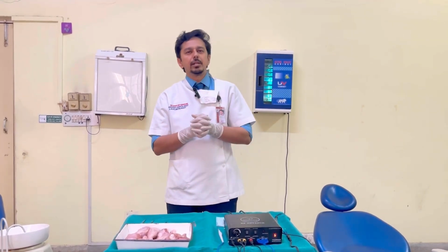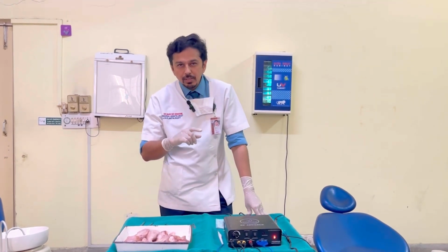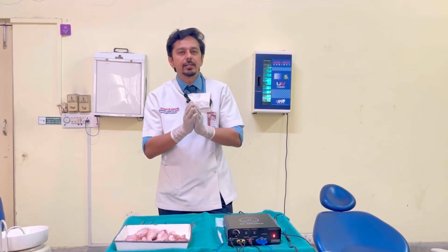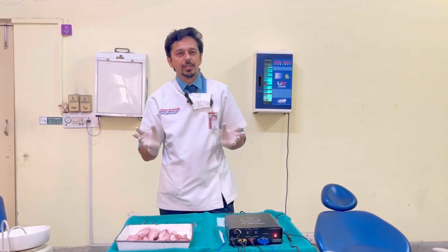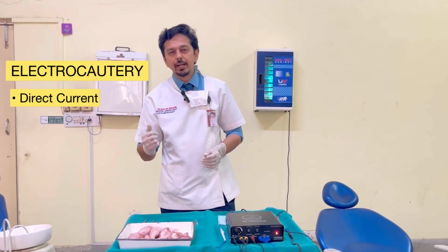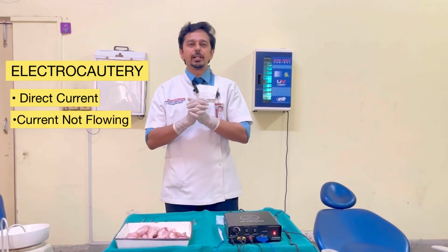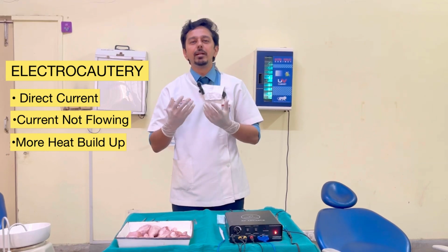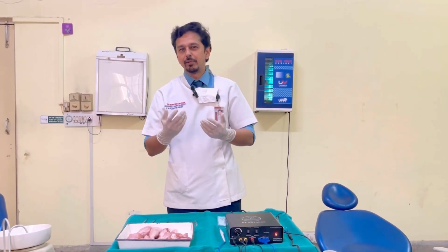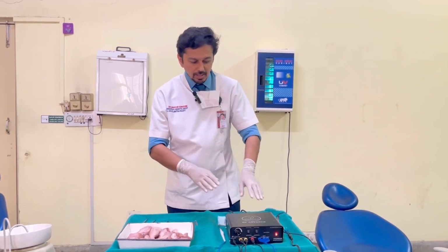So before starting with the demonstration, the first thing I would like to emphasize is that I am using the word electrosurgery, not electrocautery. Please understand there is a difference between these two terminologies. Electrocautery basically means that we are using direct current and that current is not flowing through the patient's body. So more heat buildup and more collateral tissue damage would be there when we are performing any procedure by electrocautery alone.